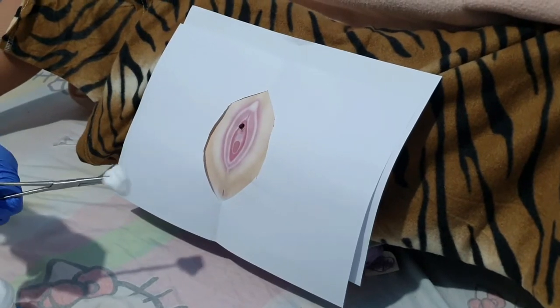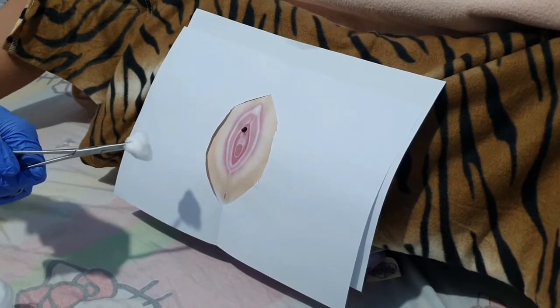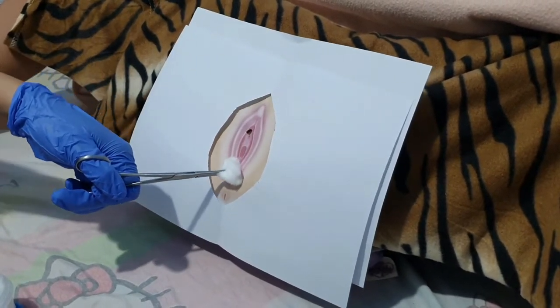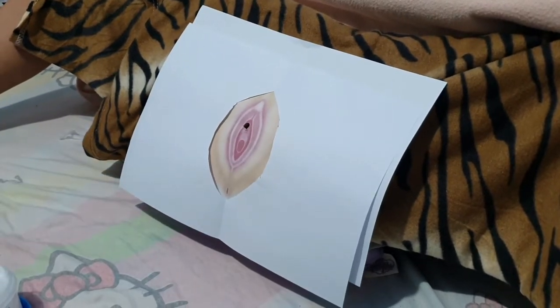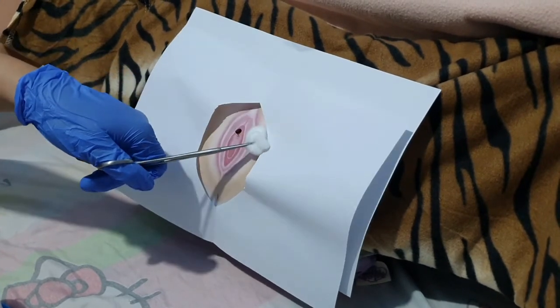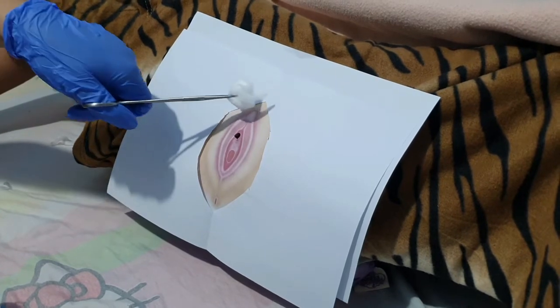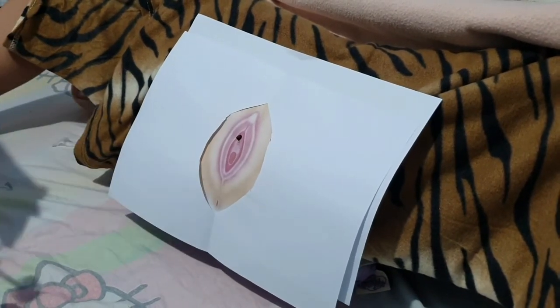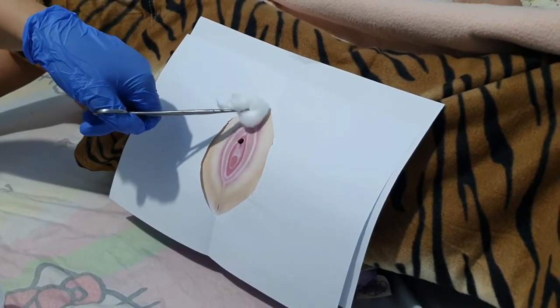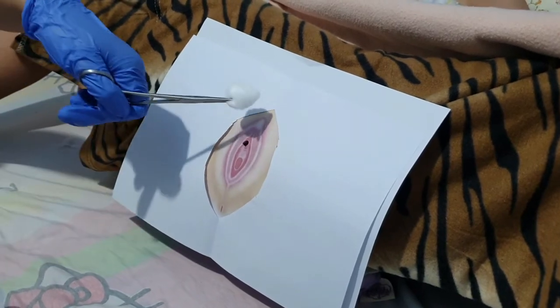Okay, next I am going to provide perineal care to my patient. I'm going to start straight from the clitoris to the anus. Next is the labia majora. And its opposite side. Then next is the labia minora. Then its opposite side.